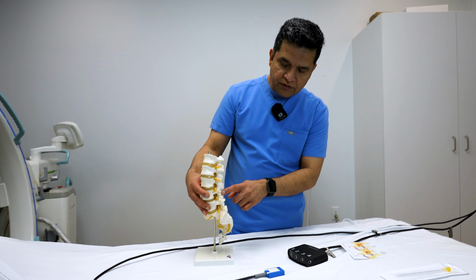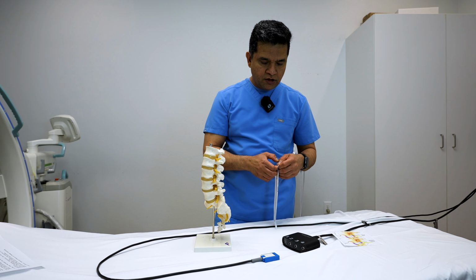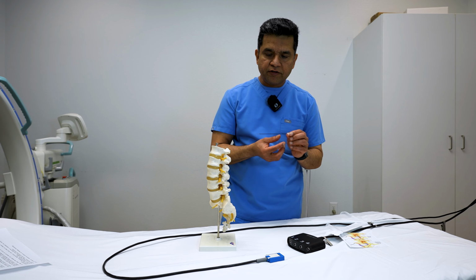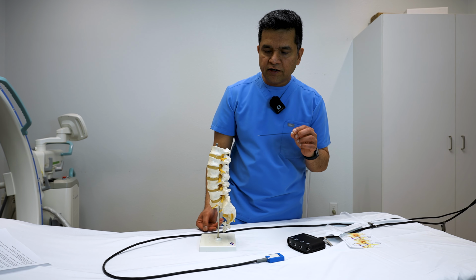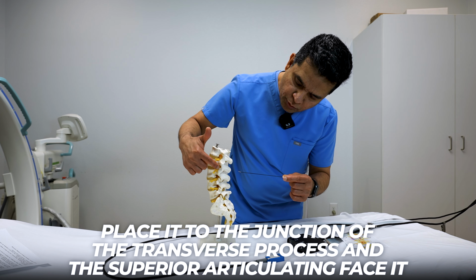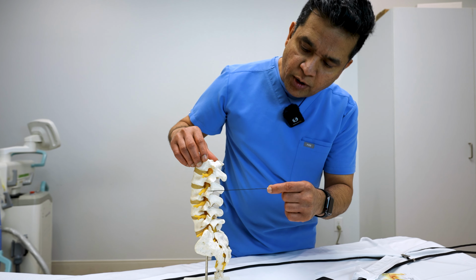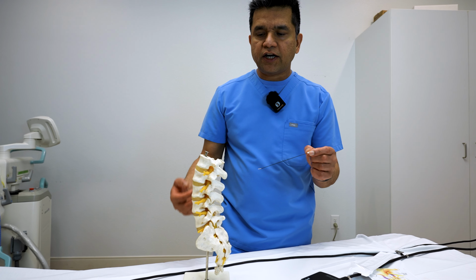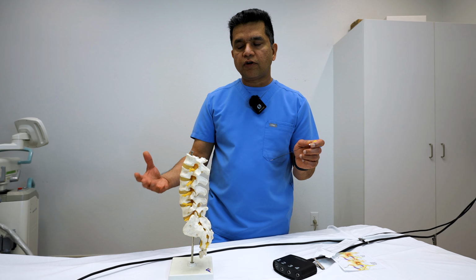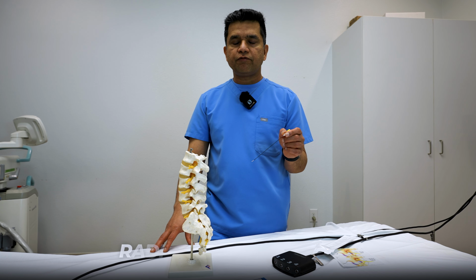So we are able to place needle, which I'll show you one here. So when we do the medial branch block, or the first step, we use a smaller needle than this, but this is a radiofrequency ablation needle itself, and you can see it's also a tiny needle. You're able to place it to the junction of the transverse process and the superior articulating facet. And if we are able to put some small amount of numbing medication, we are able to inactivate that nerve for a brief period, and that will be a positive or a good test. And if you have 2 such tests, then you qualify for radiofrequency ablation.